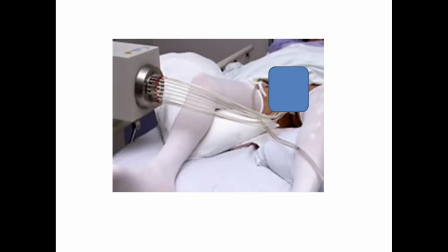And then when that plan is ready, the patient comes into the protected room, and these plastic cables here are connected to the tubes that were hanging out of the perineum, the area just behind the genitalia. And the tubes, these cables here, are connected to a lead-lined box, and inside there is the radioactive source.